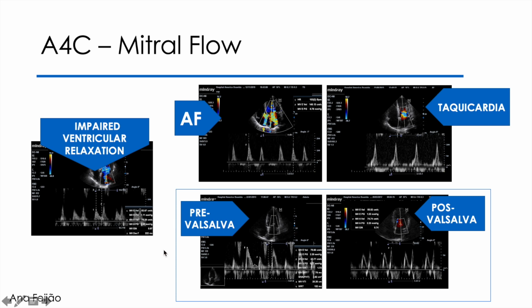We can also, as a protocol, ask the patient to perform a Valsalva maneuver, a deep inspiration or push the belly, to understand the behavior of the mitral flow with Valsalva. It gives us important data about the diastolic function. Do not forget that the mitral flow must be evaluated 10 to 12 seconds after the maneuver.